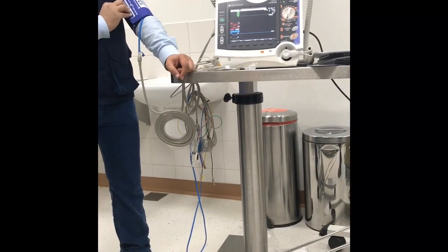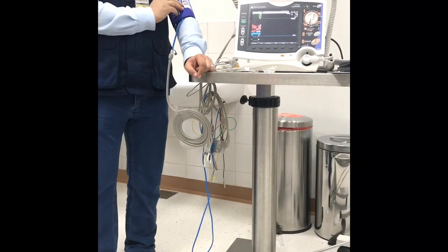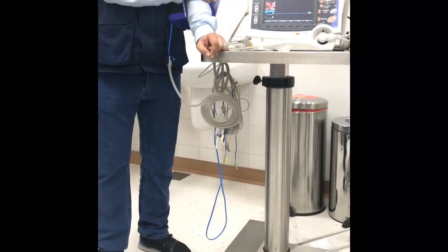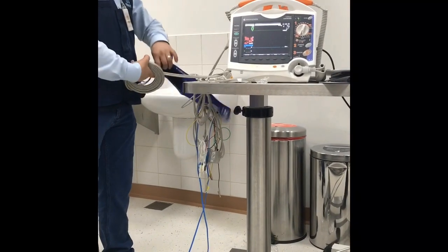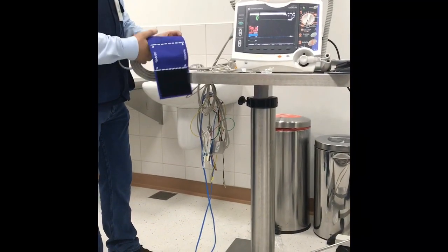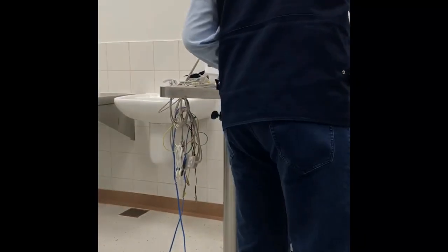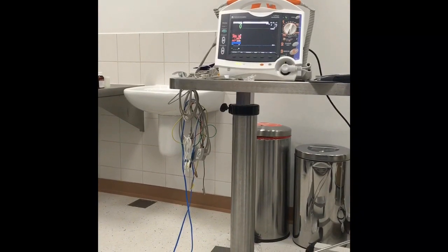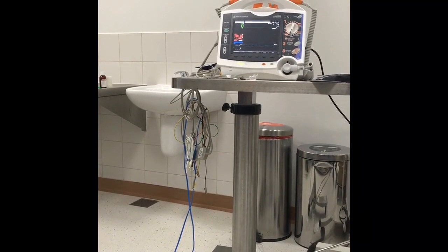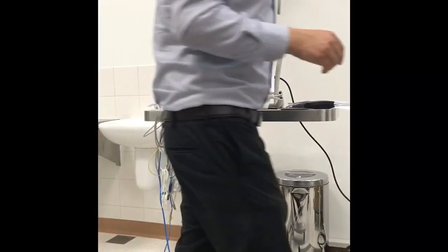So without that one, there should be. There should be what? Because the sizes are very specific for DOH: the cuffs for infant, child, adult. This is child. This is small adult. Child. Child. Can you put it on the leg? For the neonate, rather. Neonate, we don't have. But you will give this one with the different sizes, right? All the sizes. This is the size to be given. 16. These are all average. I will show you 16, 10.